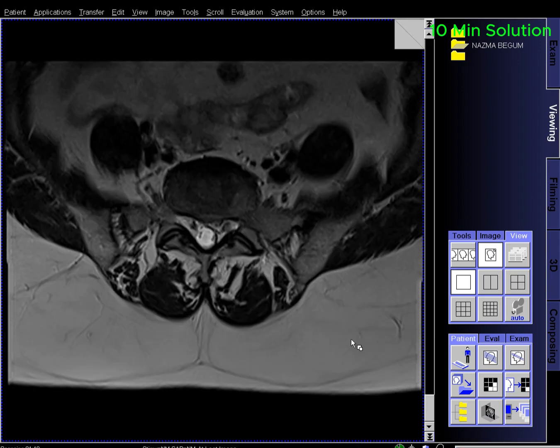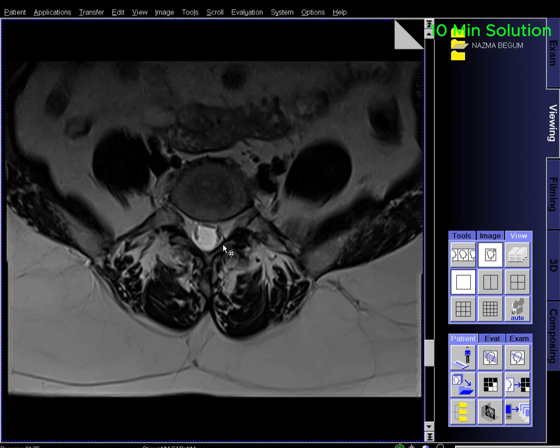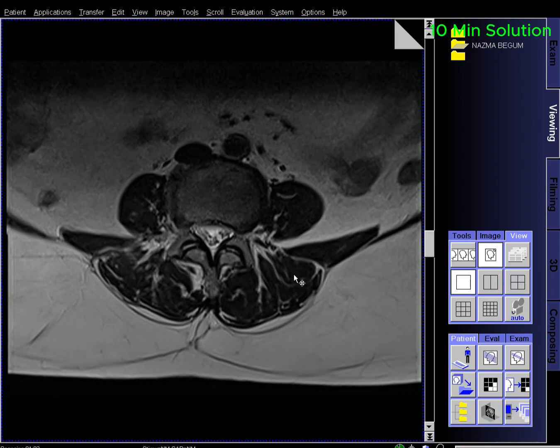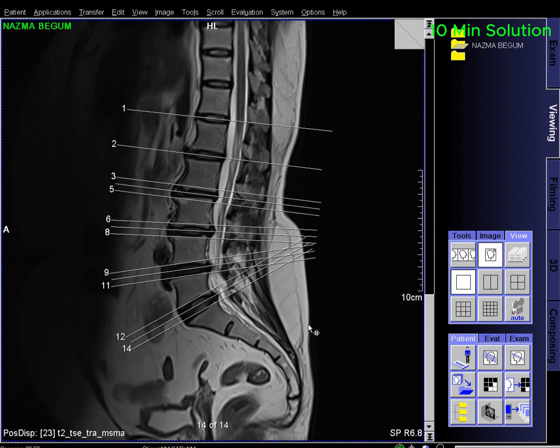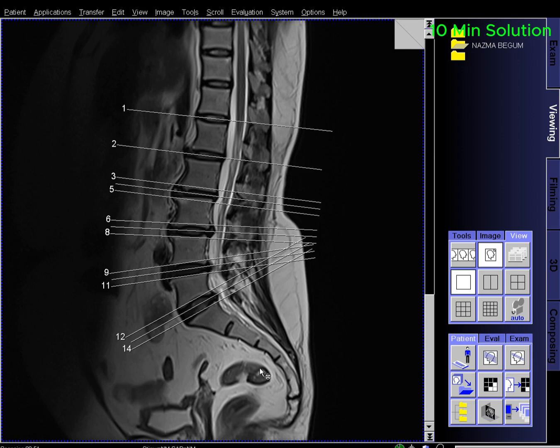Possible spinal cord injury and post-traumatic neurologic deficit. Cauda equina syndrome, e.g., sudden bowel bladder disturbance. Evaluation or monitoring of congenital malformations of the spinal cord. Evaluation or monitoring of inflammation of the CNS or meninges.